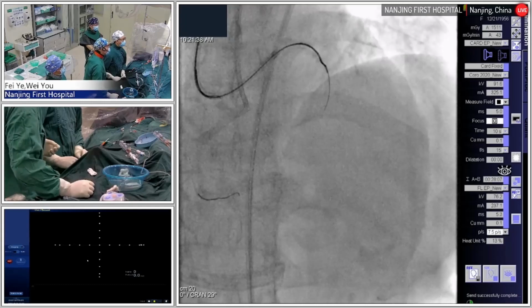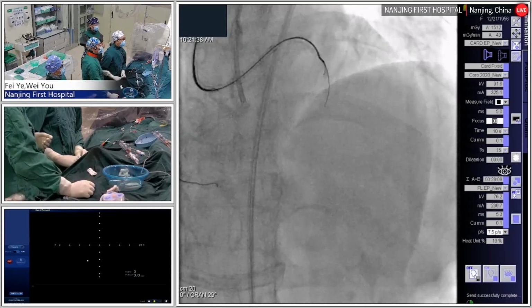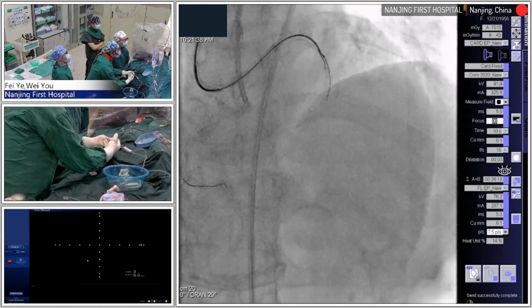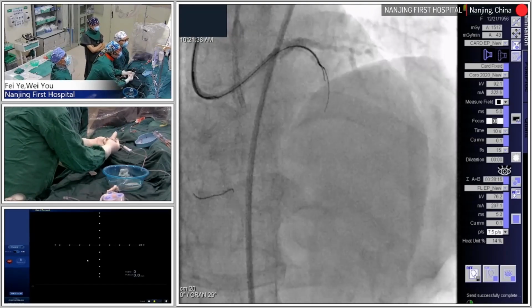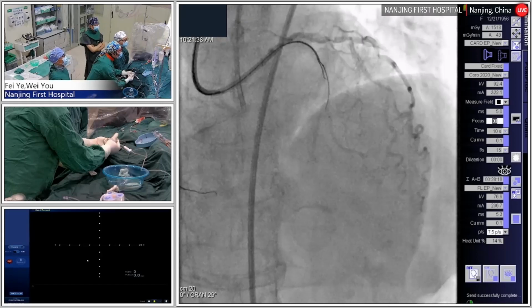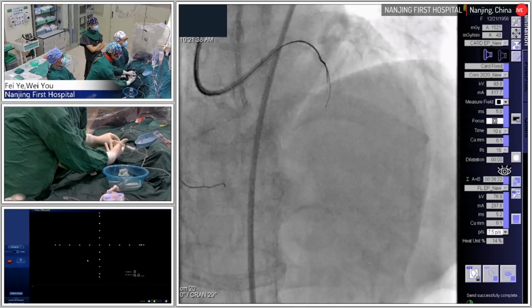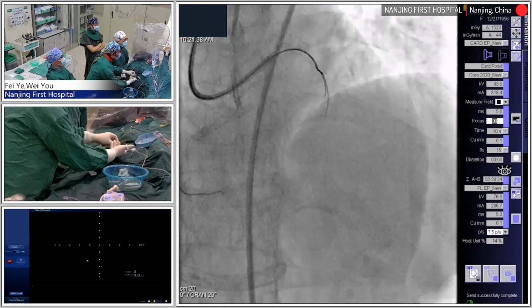It seems the wire deviates from the previous one. I think this is good. We could test, please. Small test, please, just to confirm the wire direction. Okay, test, please. Okay, it's better. Yes, it's the previous channel.